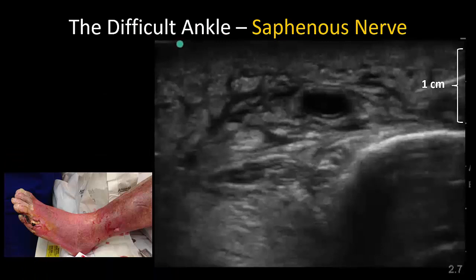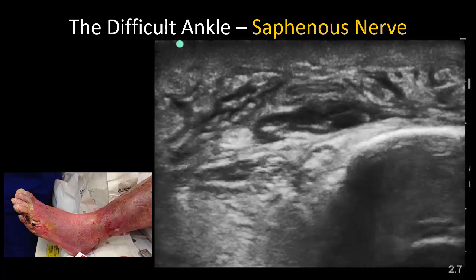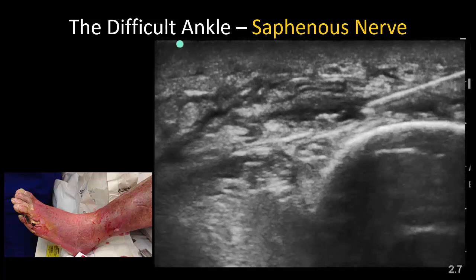In this patient, the subcutaneous layer is one centimeter deep due to tissue edema, so a blind subcutaneous injection may not deposit local anesthetic in the correct plane. Ultrasound clearly identifies the saphenous vein, which is large and engorged in this instance, and it is thereafter a straightforward process to inject local anesthetic around the vein and the nerve, which must lie somewhere adjacent to it.